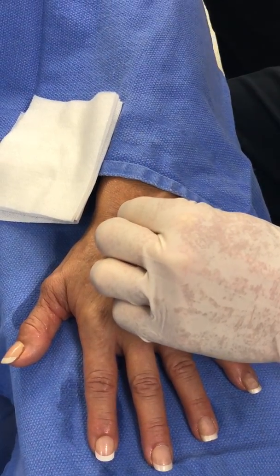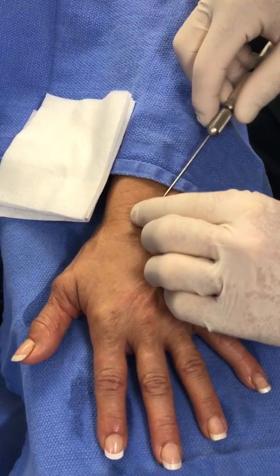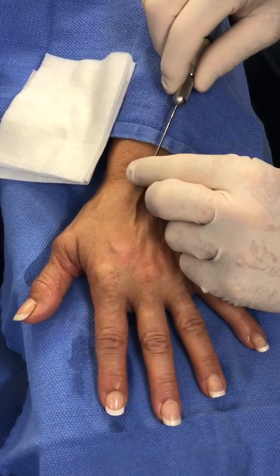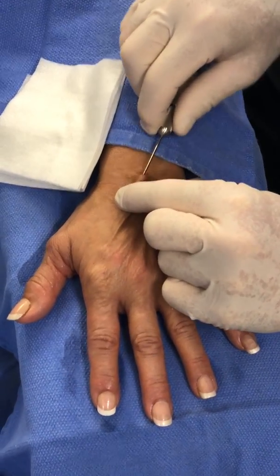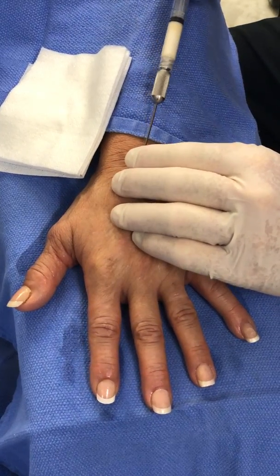So we remove that, and then what I like to do first is track down to the knuckle pads and find a nice plane there.